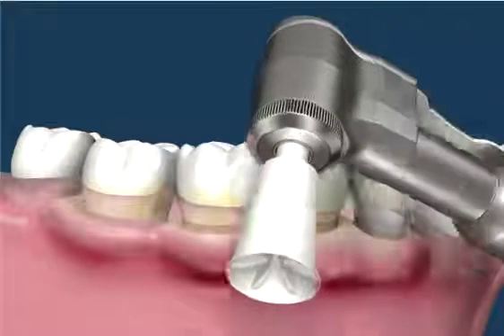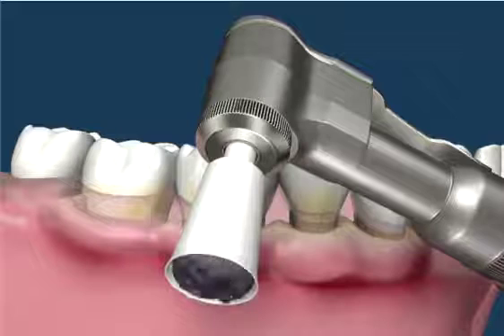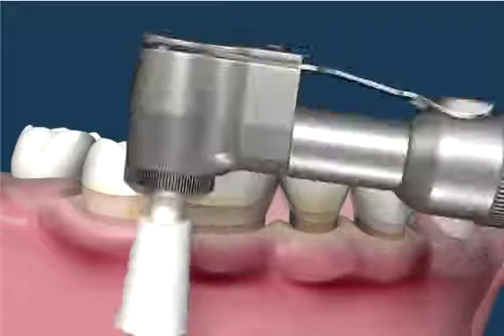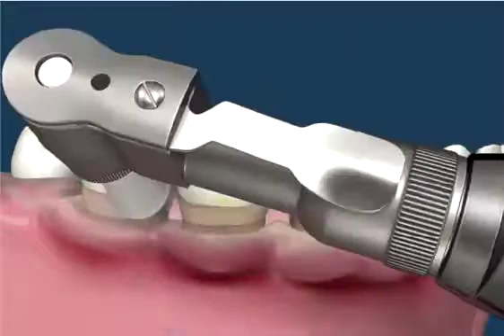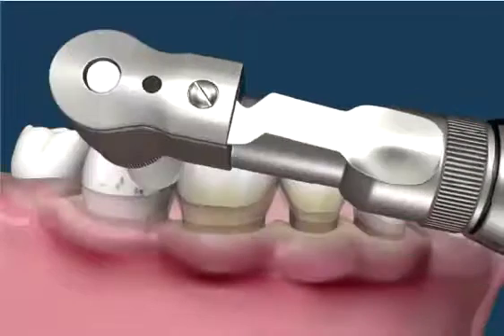Finally, the teeth can be polished with a rubber cup and an abrasive paste to remove debris and stains from above and below the gums.